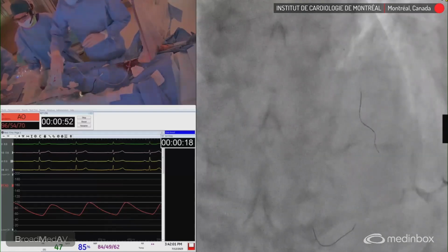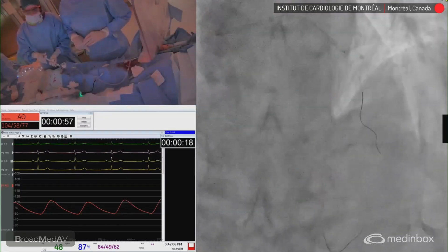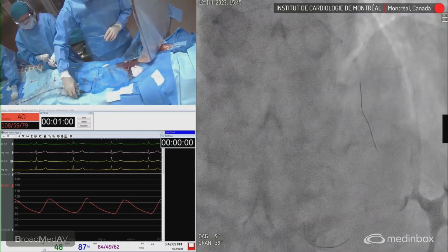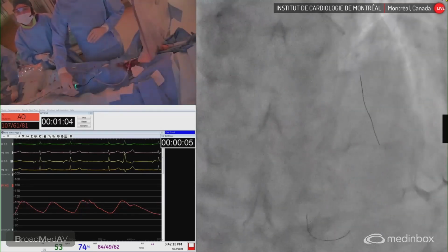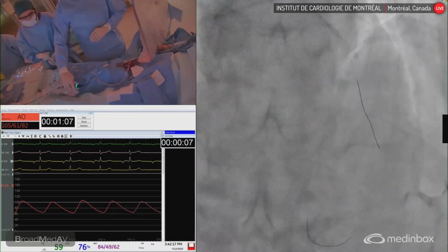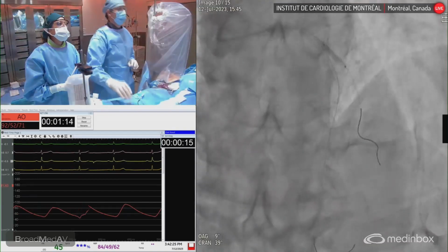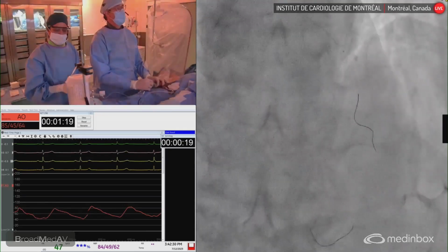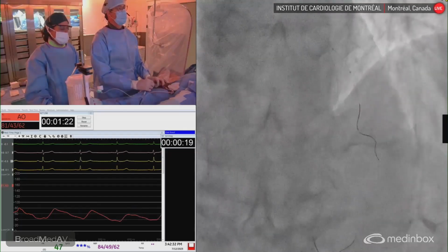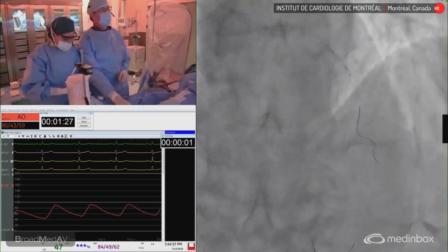Okay. Go on to 4. Go to 6. Yeah. Okay. So we're up. So we're giving the treatment right now. Seems to be well open. Yeah. I think so, yes. We'll go a little bit further down the vessel. Do you want me to? Yeah, off. Okay. Inflate again. Yeah, 6.